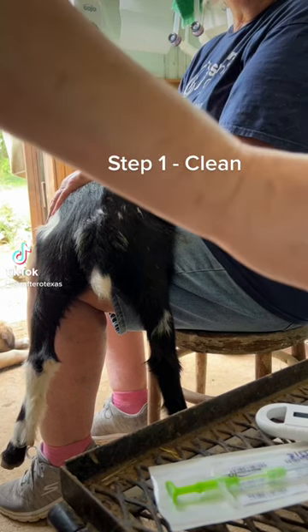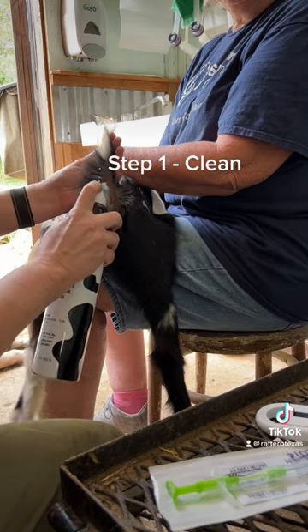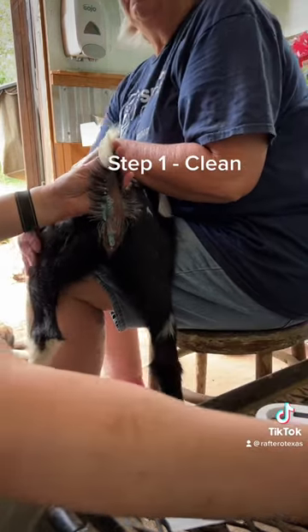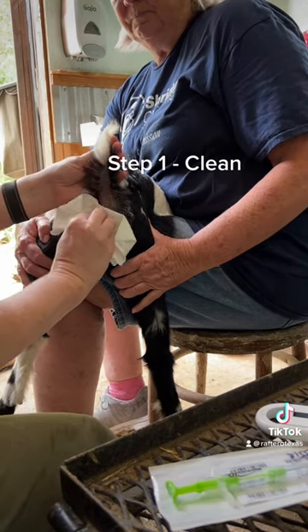We're going to be microchipping Nessie today. The first step is going on the left side of her tail web. This is Fite Back — it's pretty cold — and it also disinfects and cleans the area.